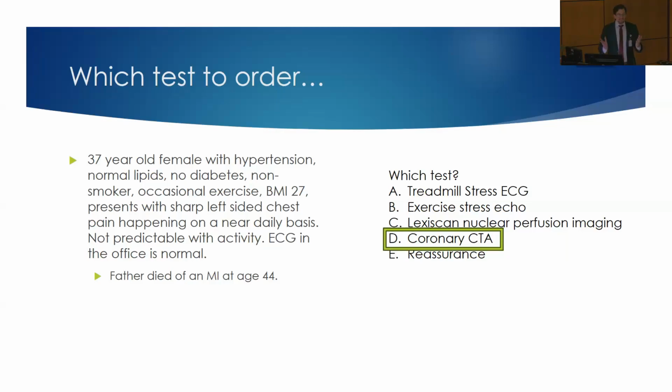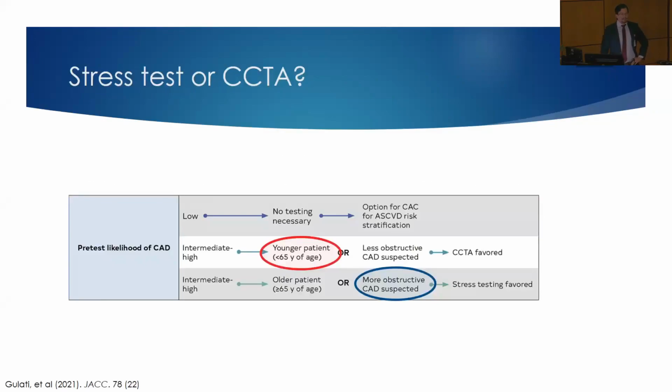So coronary CT would be the best test for this patient. And if it's normal and there's no plaque there, that's great. She'll be happy with that. Maybe the chest pain was not something really to be worried about. Maybe some musculoskeletal symptoms.